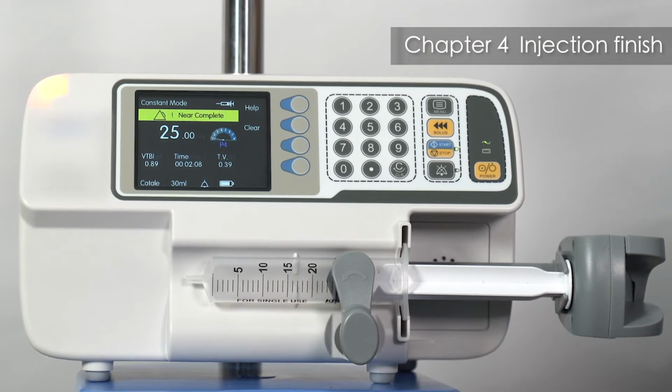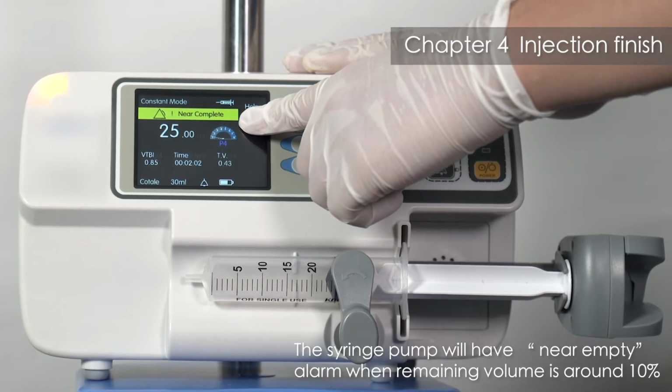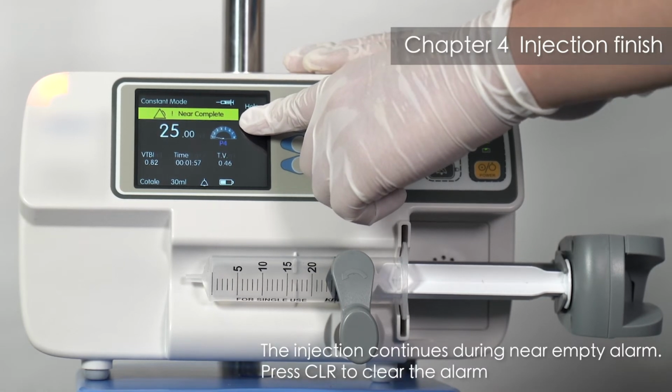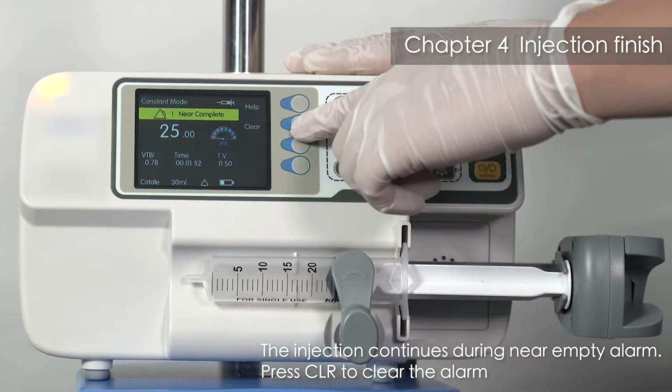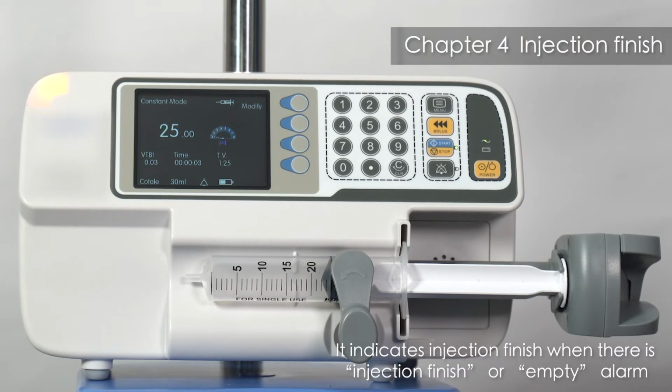Chapter 4. Injection Finish. The syringe pump will have near-empty alarm when remaining volume is around 10%. The injection continues during near-empty alarm. Press Clear to clear the alarm. It indicates injection finish when there is injection finish or empty alarm.